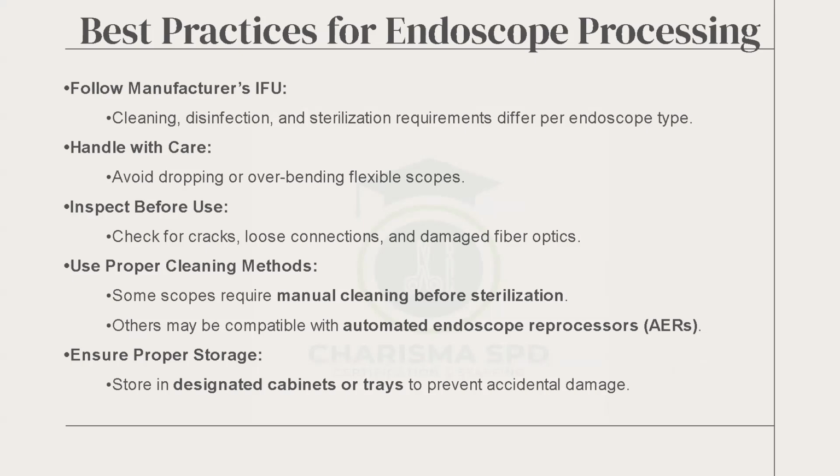Most endoscopes, some of them use low temperature sterilization, you don't have a problem. But those that use high level disinfectant, which we shall see shortly, their storage system is different. The one that uses high level disinfectant, it means it is not sterile, but they disinfect it to be able to use.